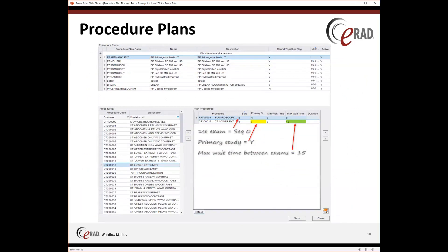On this screen, you can see that the first exam is the fluoroscopy exam and the sequence is set to zero, meaning that is the first exam to be done in this procedure plan. The primary study is actually set to the CT and marked with a Y — that will be the primary exam that the reporting goes on, even though the report will be applied to both exams. The max wait time between them is 15 minutes, meaning that if the fluoroscopy was at 8 and it's a half-hour exam, then your CT could be scheduled at 8:30 or 8:45 being the max.